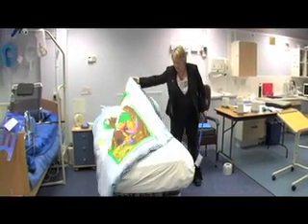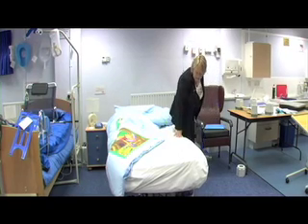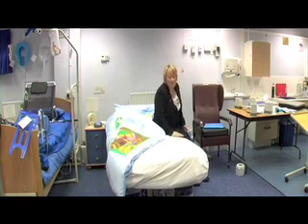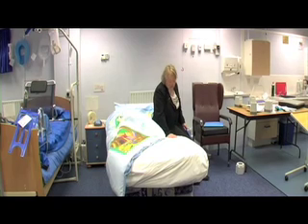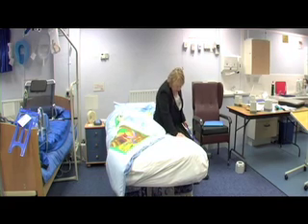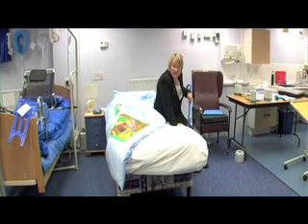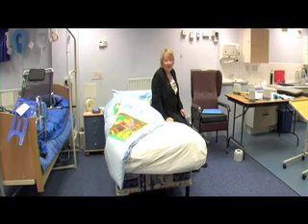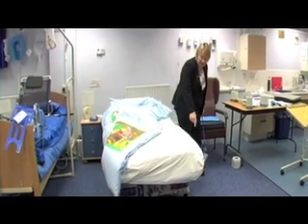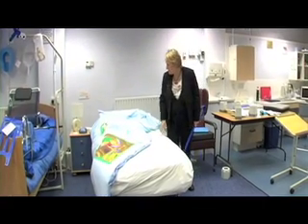Again, as with the chair, you need to actually think about the giveness of the mattress. So if somebody's having difficulty getting out of bed and it's too low, this is often the problem, and they may need to consider getting a different mattress. But if you're going to measure for a height of the bed, you need to compress the mattress, measure the client's leg length, and then measure the mattress, and then work out the height that you want. Again, some people are very concerned that if you've raised it, you can't move it again to vacuum underneath it.